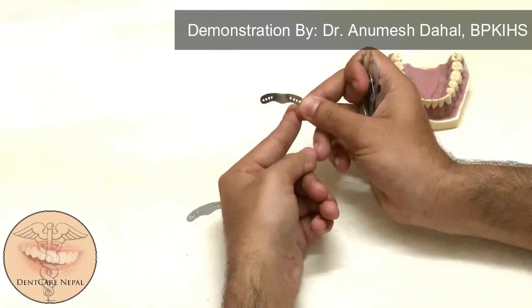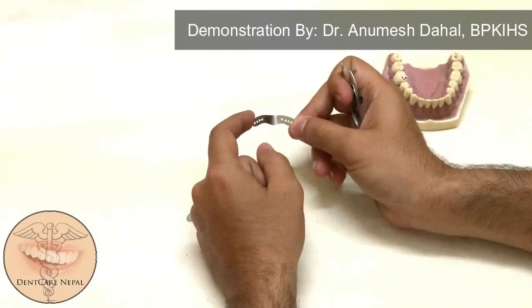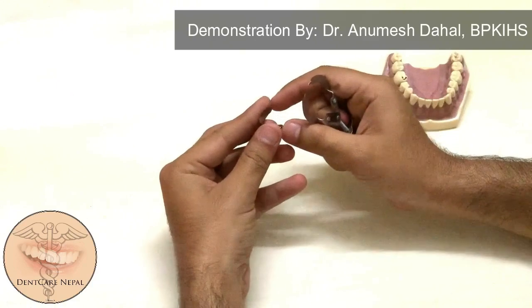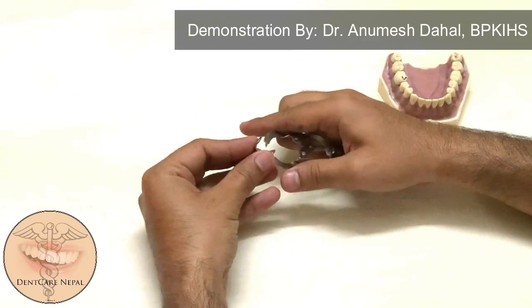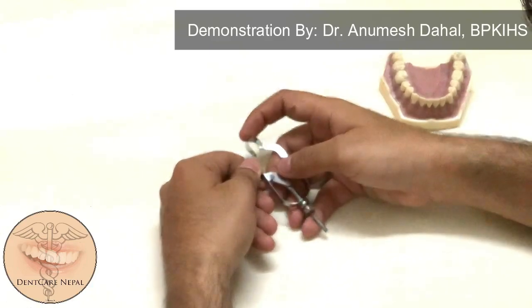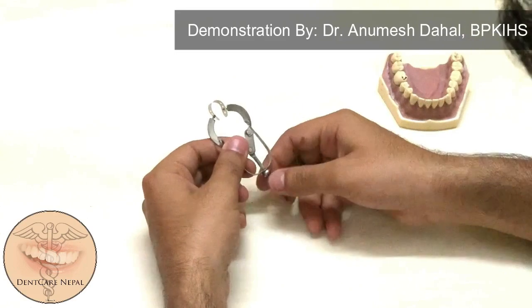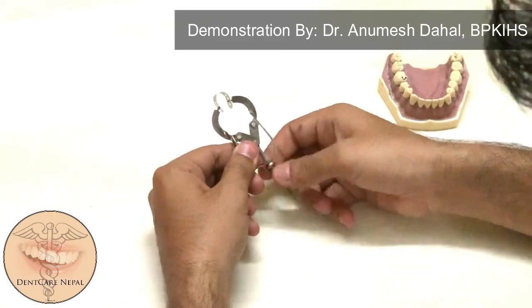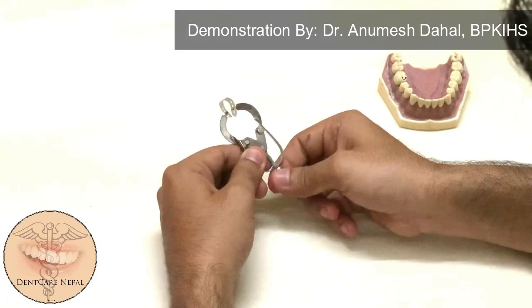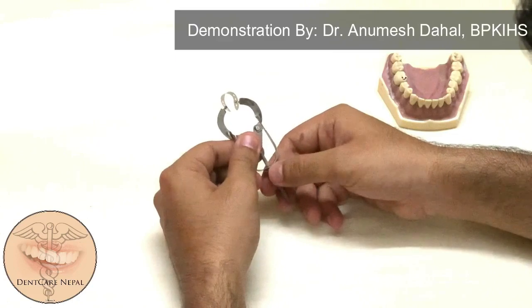The band shows holes at different distances from the midline so that we can adjust the placement of the band as required. Now let's take the third hole. As I tighten the screw clockwise, the pincers come close together and they tighten the band. Undoing it releases the band.